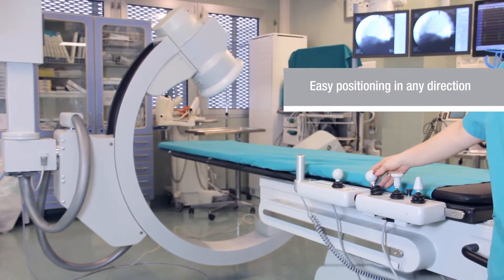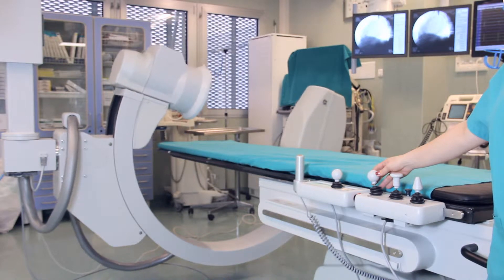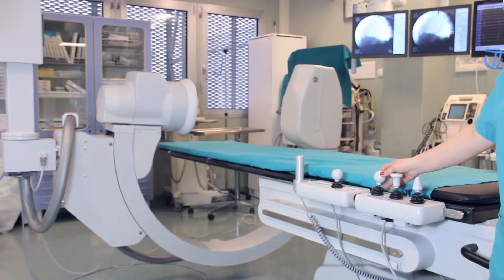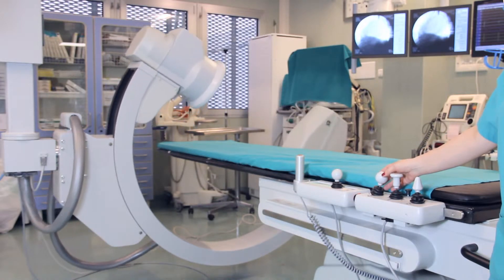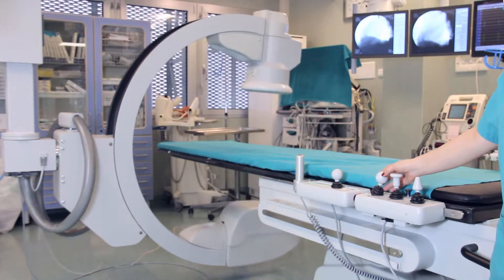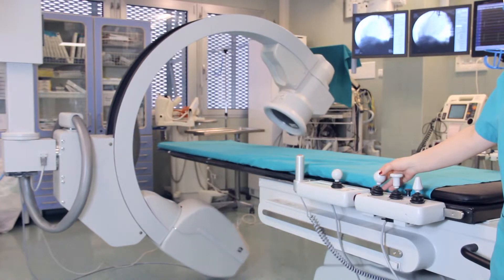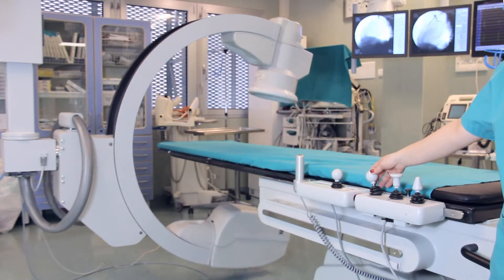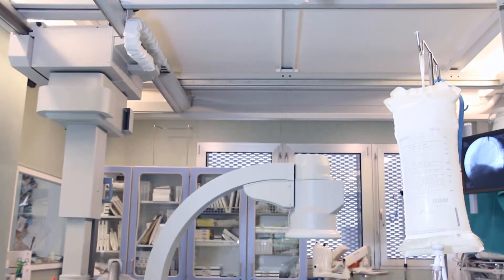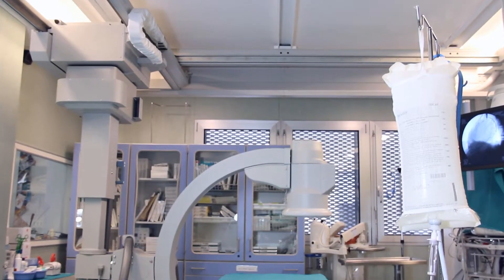The isocentric stand expands diagnostic options, which is especially necessary for heart surgeries. The device can be placed even in a small room, as the ceiling mount doesn't reduce the space in an operating room.